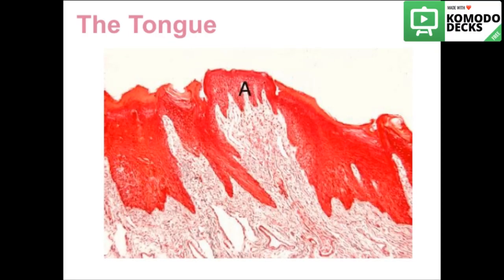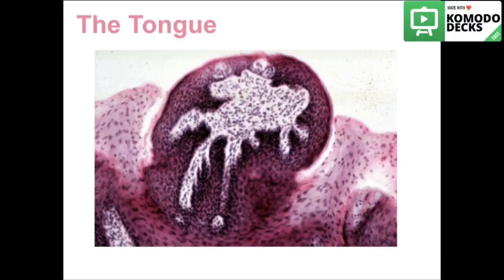Also a section of a foliate papilla found on the lateral surface of the tongue. A fungiform papilla with multiple taste buds.